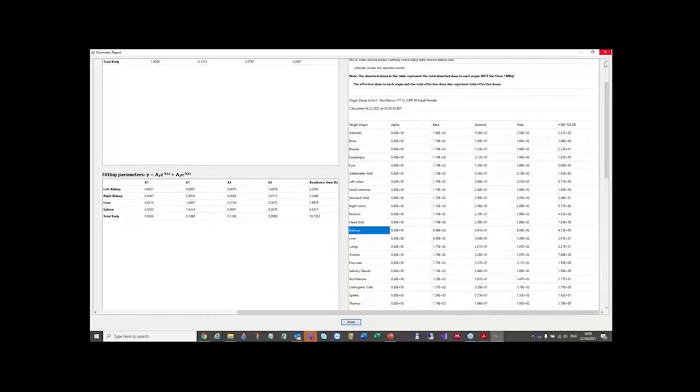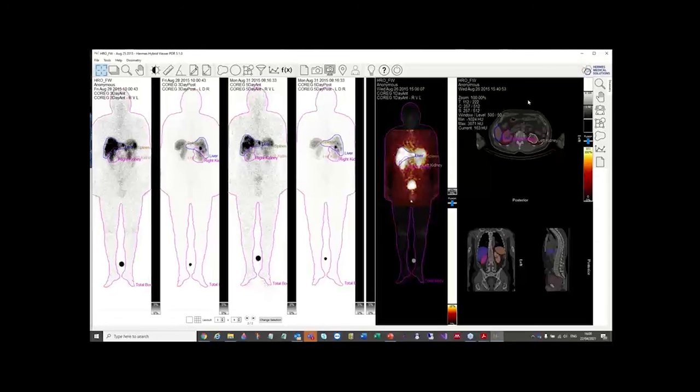All right, Steve, I think that's brilliant. Thank you very much, Helena. And just to confirm, these are all CE marked, correct?